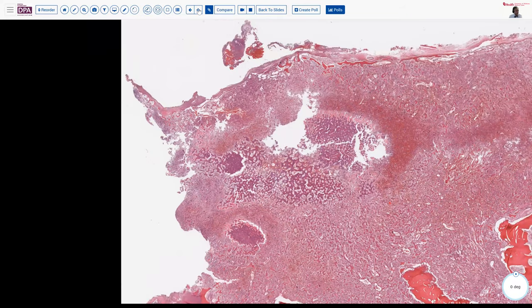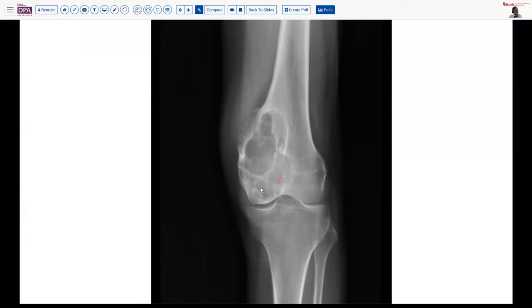All right, well, let's see if we can get a couple more of our cases shown here. Here is another lesion, and I show you this case because it's a very, very classic case. This is the radiographic appearance that many radiologists will say is a soap bubble lesion. And by that, they mean it's got a lot of rounded spaces with a little peripheral rim of accentuation. And here you can see it's distorted the cortex, maybe partially destroyed it, but it does appear that it's probably not extending into the soft tissue, but it's got these nice rounded spaces.